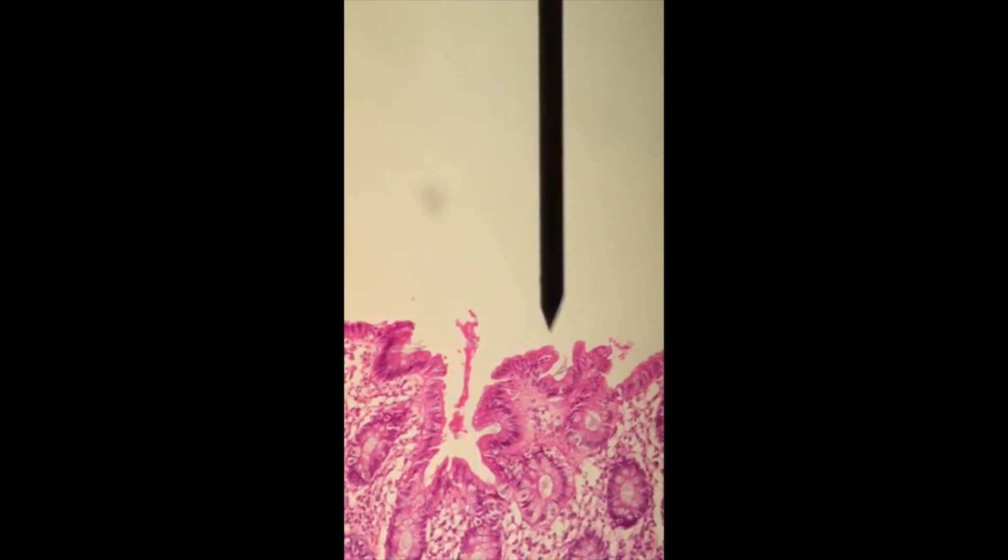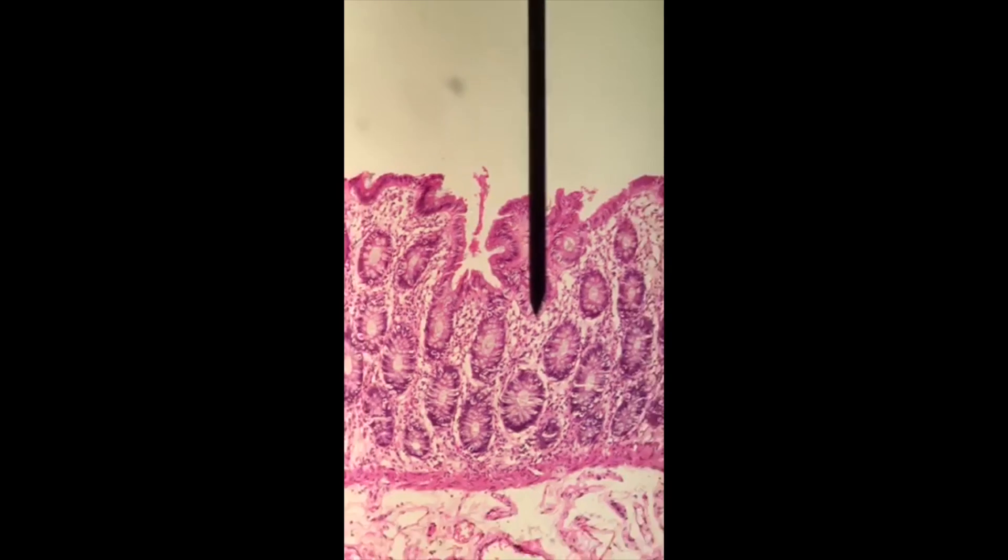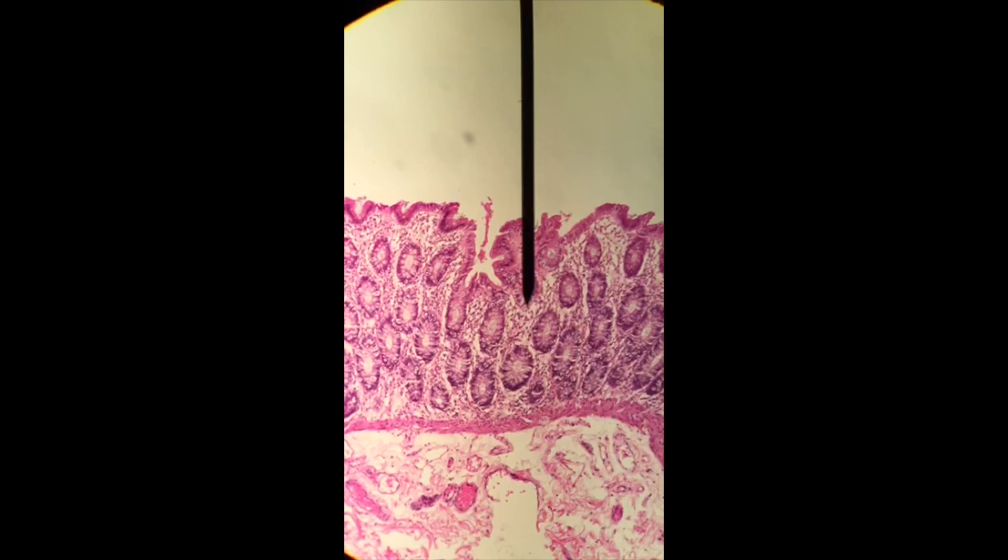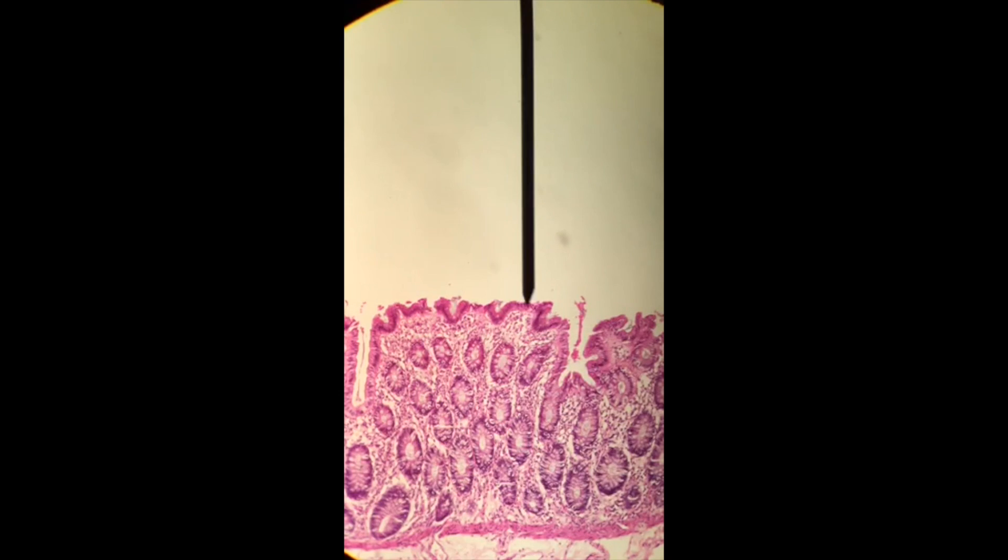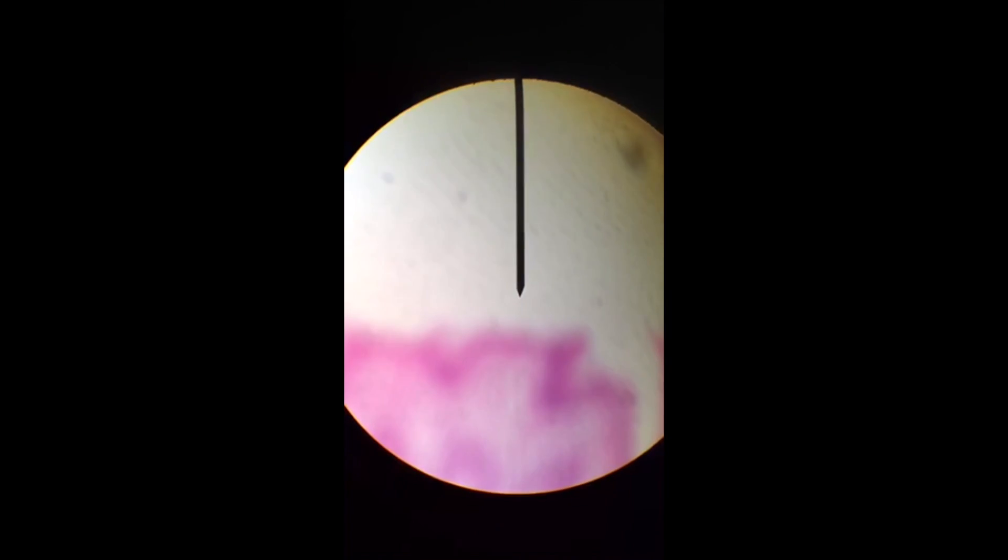Again, notice that our cells are going to be simple columnar. Notice that we are lacking villi and microvilli like we see in the small intestine. We no longer have those structures.